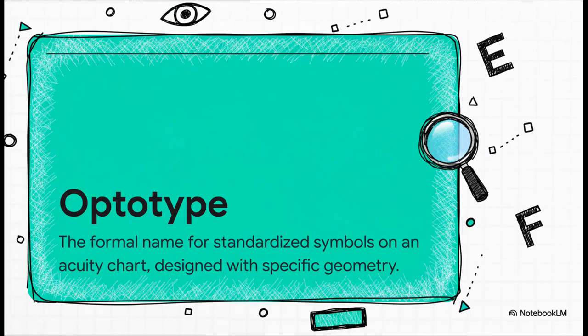First things first, let's get the language right. As clinicians, you need to know these are not just letters. The proper term is optotypes. And using that term shows that you get it, that you understand these are carefully constructed, scientific instruments, not just random characters from the alphabet.